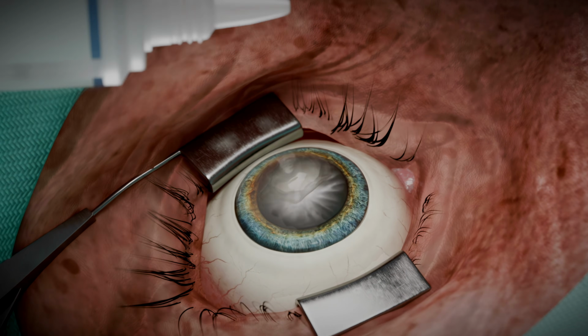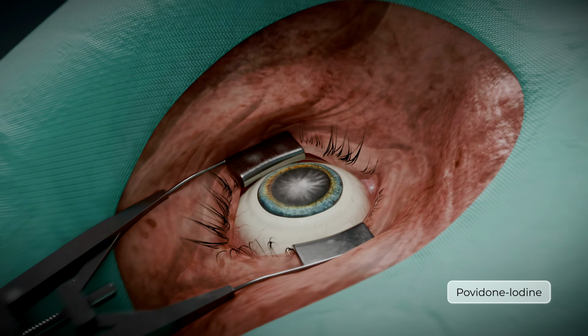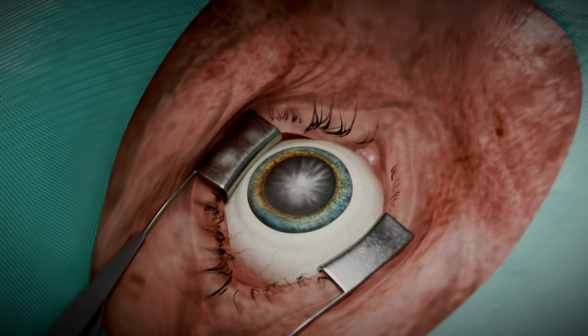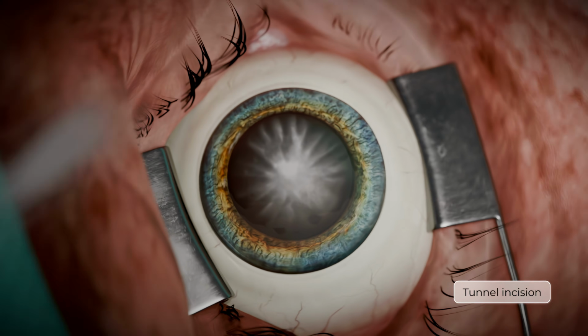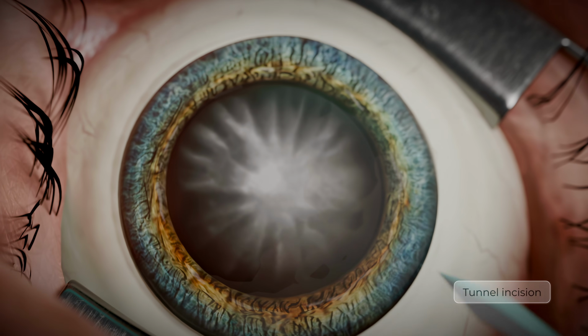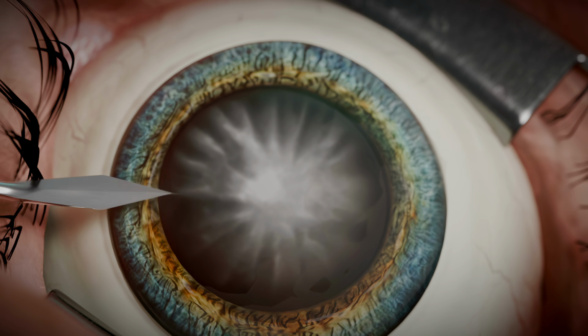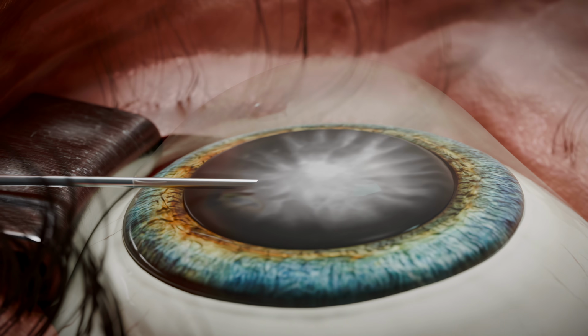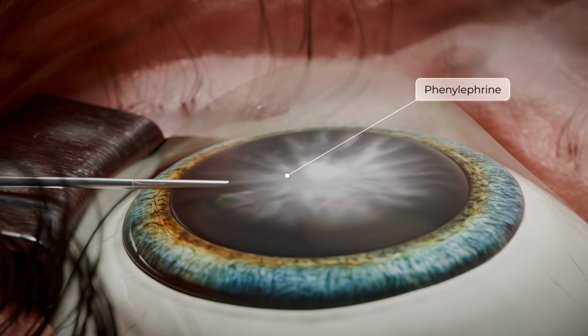Phacoemulsification is a modern surgical method for treating cataracts. Phacoemulsification proceeds in several stages. First, local anesthesia is administered, which may involve installation of anesthetic, eye drops, or a subconjunctival injection. Afterward, corneal incisions are made to gain access to the lens. A mydriatic is gradually introduced into the anterior chamber to dilate the pupil.